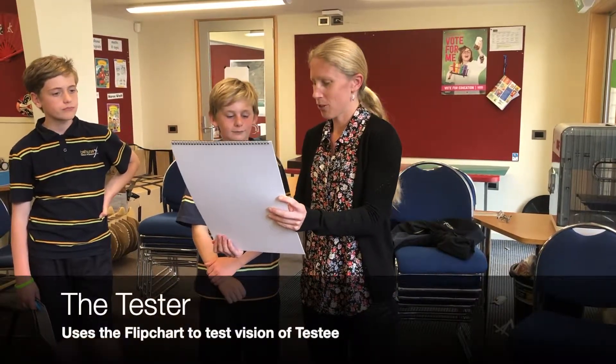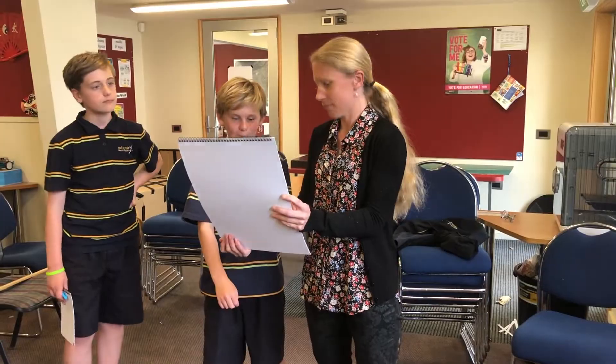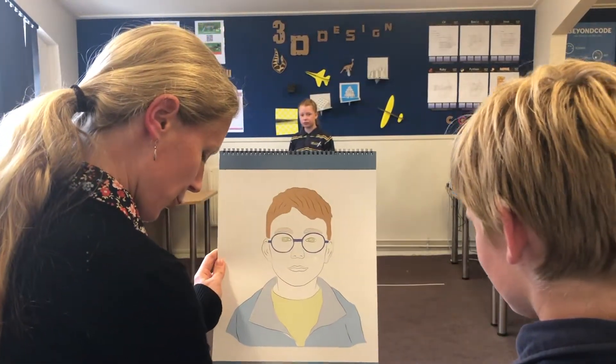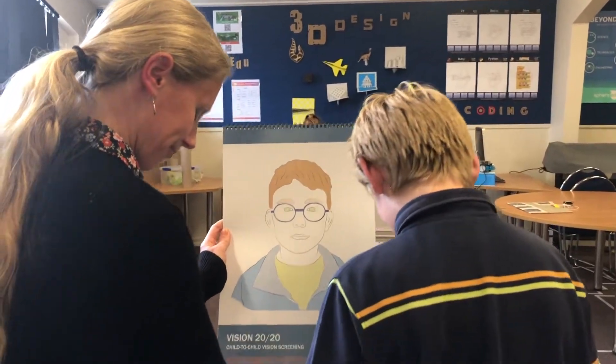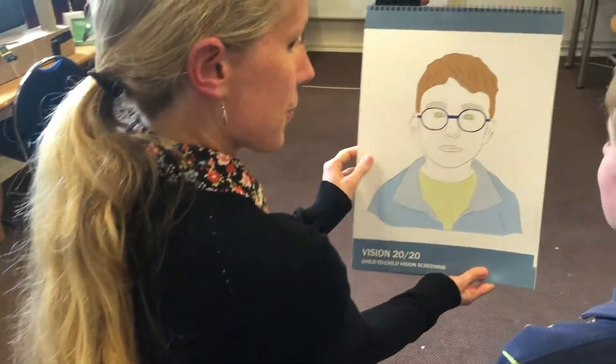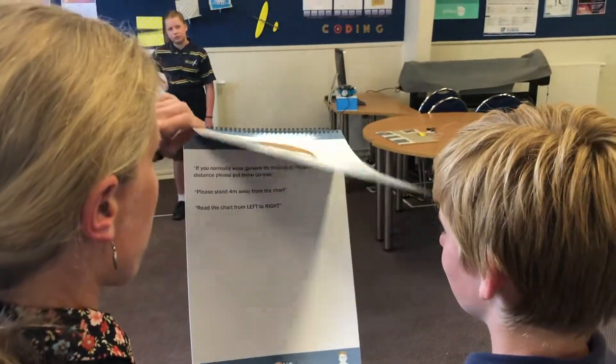Ethan, you're the tester, so I'm going to show you what the tester's role is. This is the testing booklet. You're going to stand with your feet right on this white line, and you're going to always have this face facing you — so you turn the pages away from you.